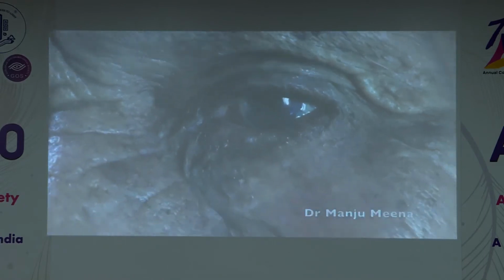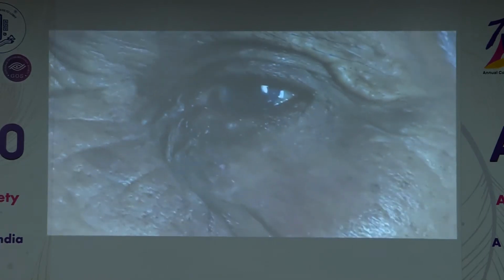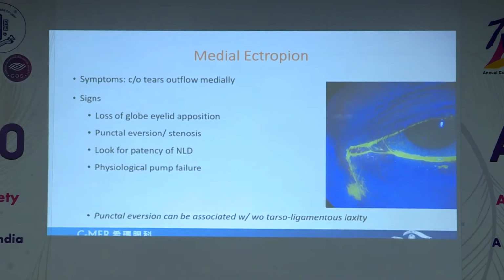So once we've checked the amount of laxity, we can decide about our plan of management. The ectropion can be medial, lateral, or central. For the medial ectropion, most of the patients complain of epiphora, which is medially. So it's better to do a fluorescein dye disappearance test to look for the tear meniscus height and also to check whether there is any drainage of the dye into the nose. Okay, so we can see here the tears are not going in, they are just going out. So it is always important to do syringing in this patient to look for the patency of the nasolacrimal duct.